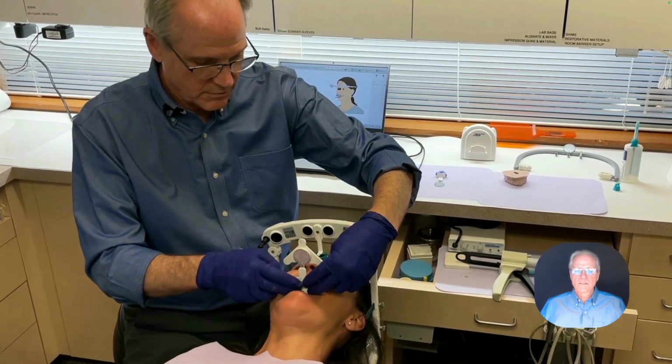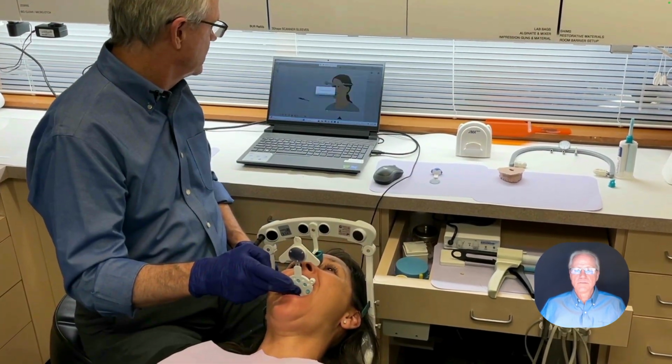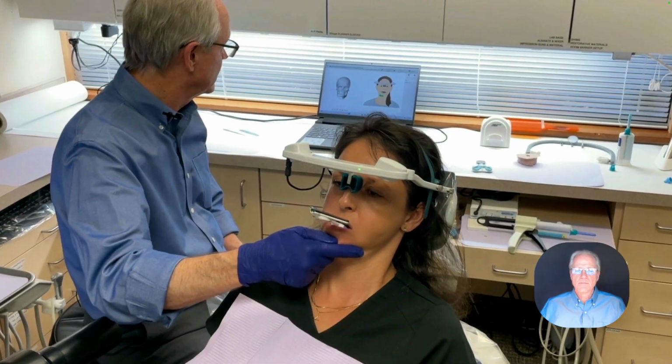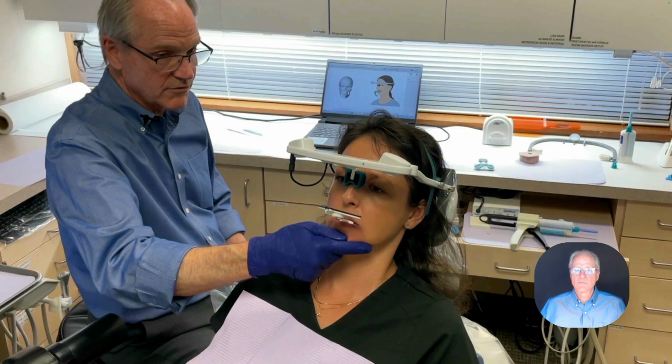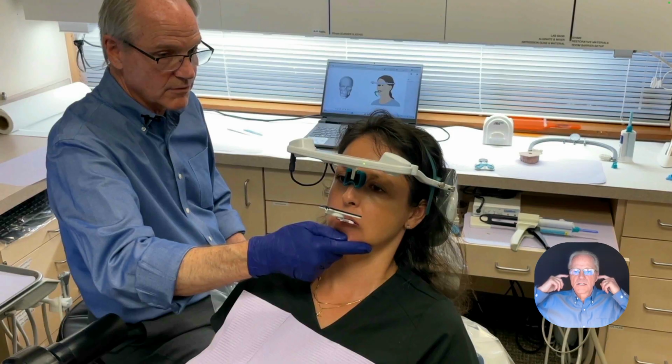So it's quite easy to do. Right now you go ahead and you put up the maxillary arch. I'm just doing a quick demonstration of how simple it is. And we can measure the maxillary arch as it relates to the hinge axis. And we can measure the movement forward, backwards, side to side. And with that, we have recorded the mandibular movement and can analyze it.